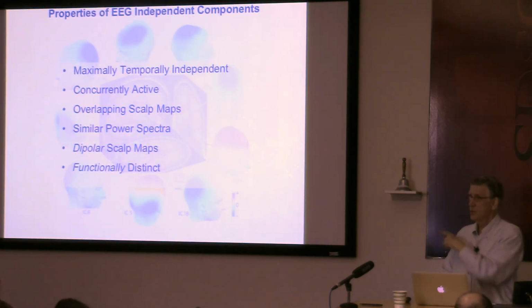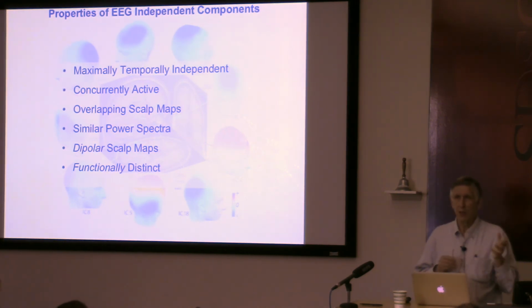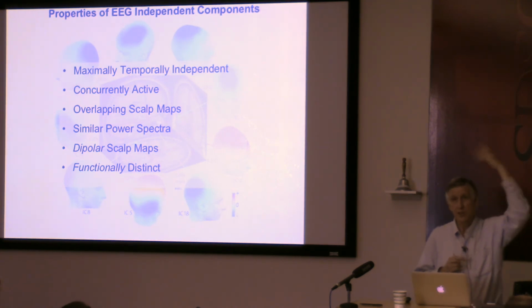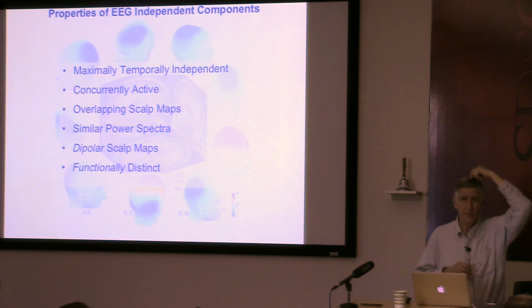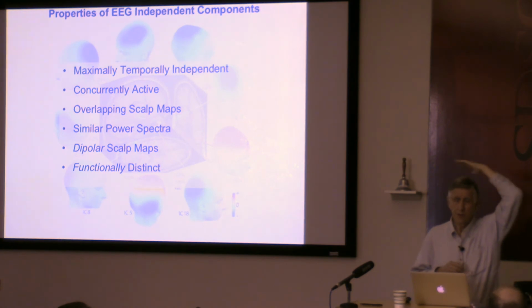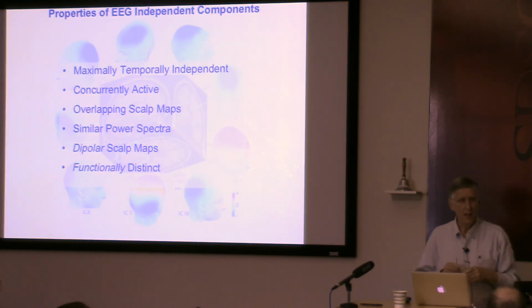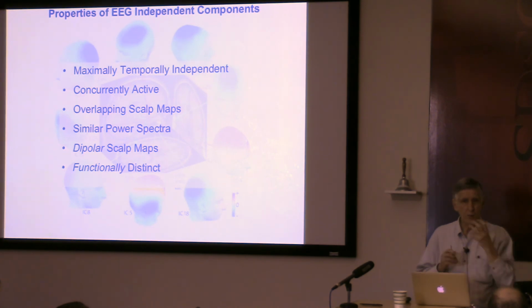And I didn't have time to show you the ERP paper that we did, Rissling et al., which took a mismatch negativity, standard auditory paradigm, with data from schizophrenics and non-schizophrenics collected here at UCSD, and decomposed it by ICA, and found a network of 6 frontal, temporal, and parietal sources that contributed to this mismatch negativity.